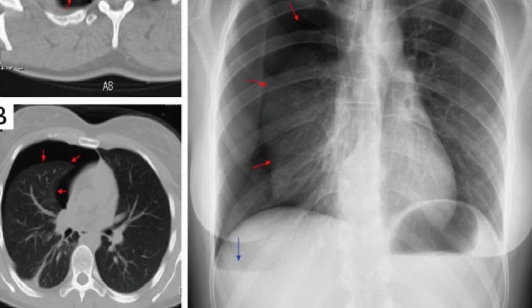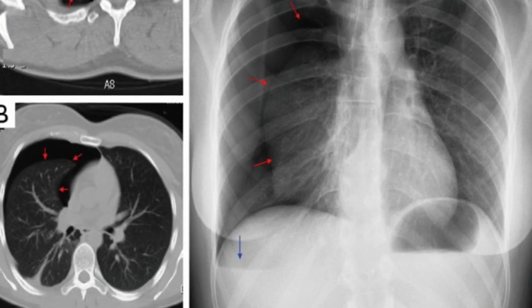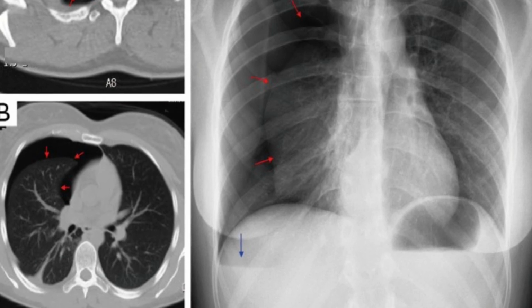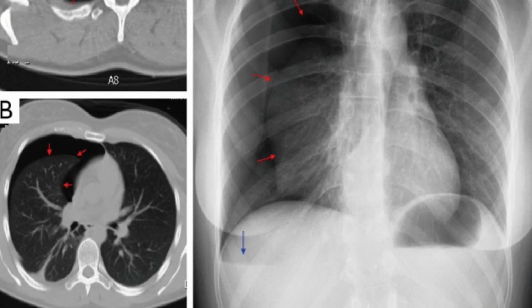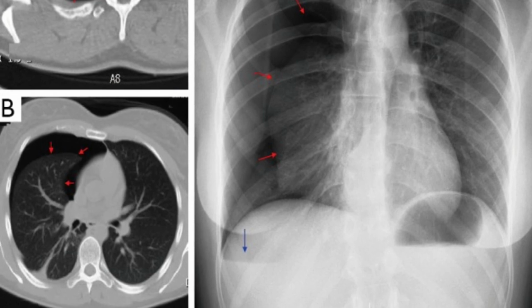Imaging features are often identical to pneumothoraces from other causes. Rarely, small diaphragmatic defects may be encountered, representing small perforations of the diaphragm. These may also present as a nodular appearance of the diaphragm. Cases of larger perforations presenting as basal thoracic opacities have also been described.